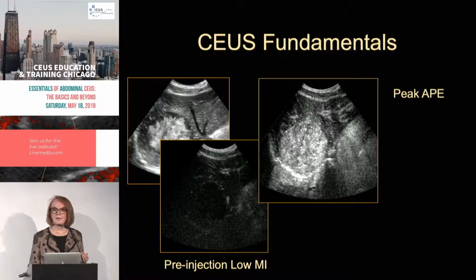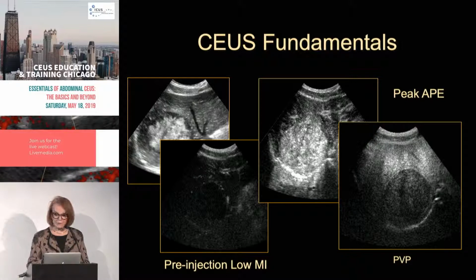So one of the big comments that we make when we're doing contrast ultrasound is how is the mass enhanced: equivalent to the liver, less than the liver, or as here, is this a hyper-enhancing mass? And so when you're reading literature on ultrasound evaluation of masses, you'll see the abbreviation APHE, arterial phase hyperenhancement. And that's such an important observation. So many masses have it, benign and malignant masses. But there we can see that at the peak of the arterial phase, the enhancement is in excess of the liver. And then we keep watching perhaps for many minutes.